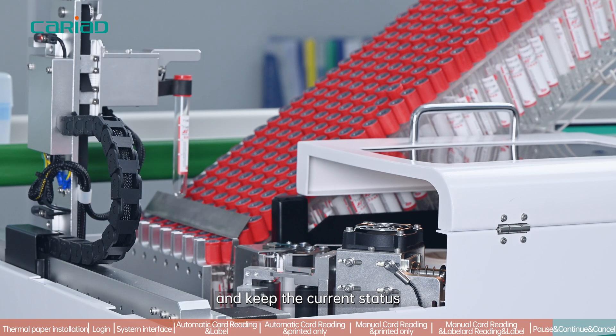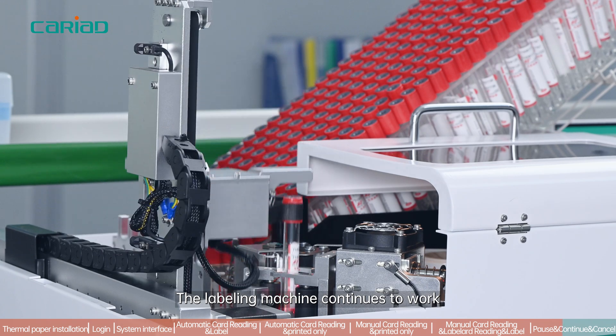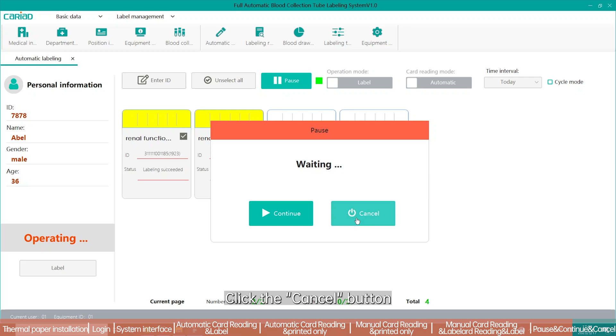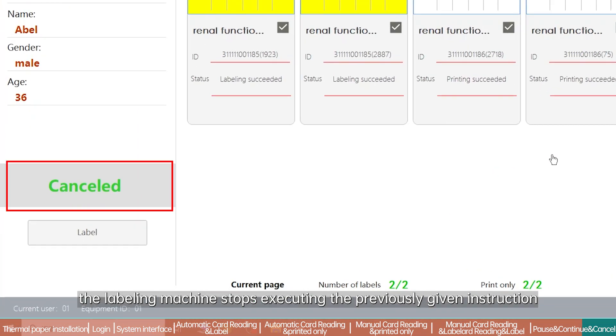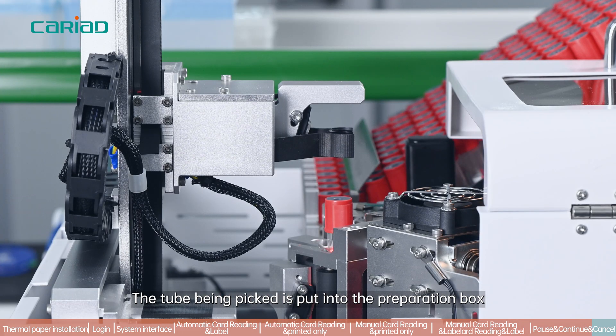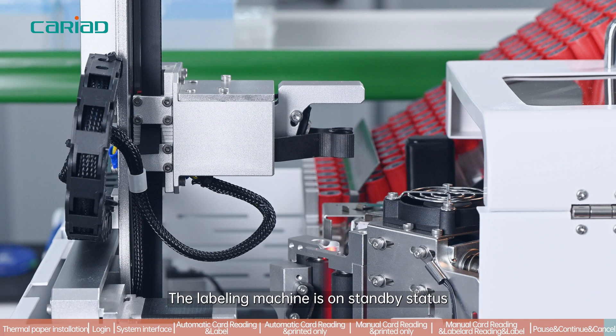During the automatic labeling process, clicking the pause button causes the labeling machine to automatically pause work in progress and keep the current status. Clicking the continue button resumes work to complete the unfinished labeling action. Clicking the cancel button stops execution of the previously given instruction; the tube being picked is placed into the preparation box, remaining unlabeled instructions are not executed, and the labeling machine returns to standby status.